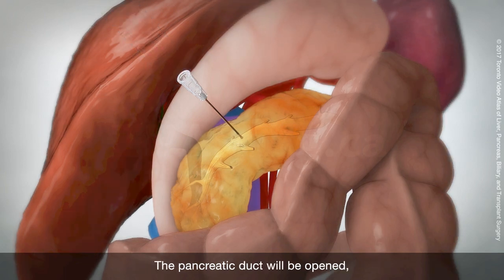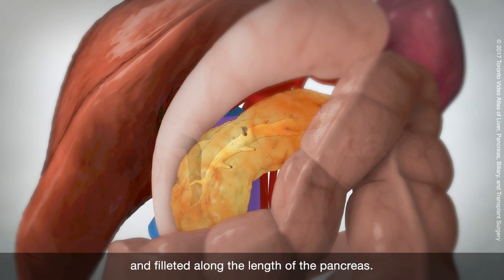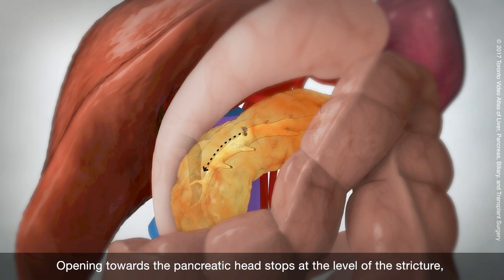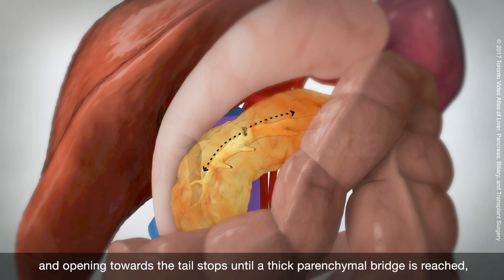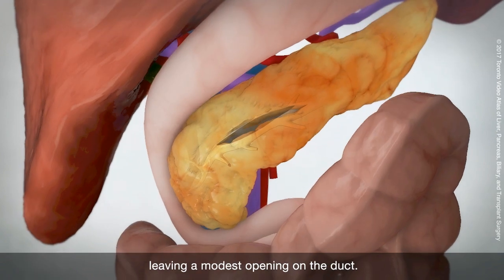The pancreatic duct will be opened and filleted along the length of the pancreas. Opening towards the pancreatic head stops at the level of the stricture, and opening towards the tail stops until a thick parenchymal bridge is reached, leaving a modest opening on the duct.